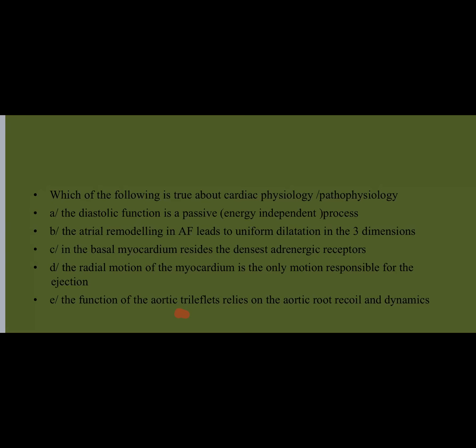It's the anterior posterior. Why the anterior posterior? Because the left atrium is restricted by the sternum and by the spine from behind. So this dimension of enlargement is restricted by the bone skeleton. But inferior-superior and mediolateral is not restricted. There is soft tissue all around you, so it can dilate without any problem.